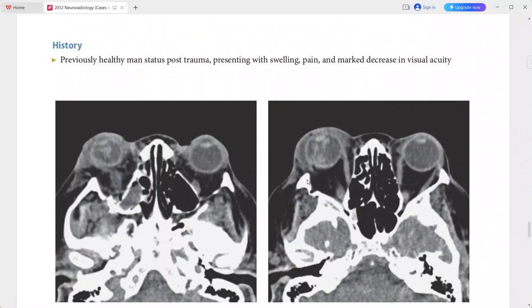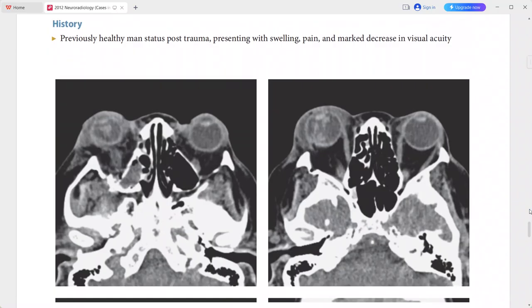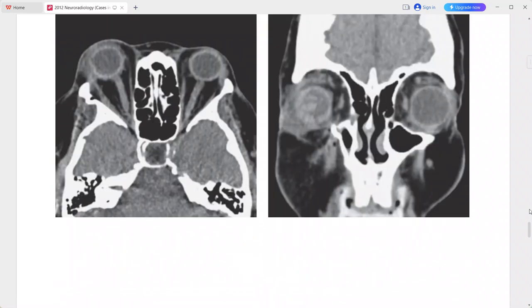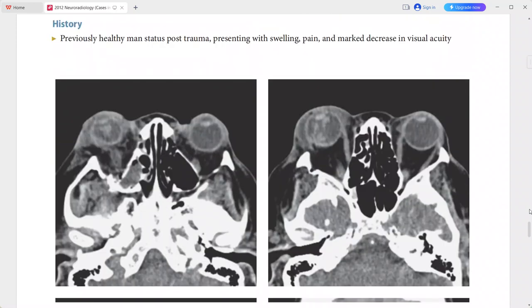Next is a previously healthy man status post trauma presenting with swelling, pain, and marked decrease in visual acuity. On CT scan, there is periorbital swelling on the right side with contour deformity of the right globe. There is high attenuation material within the right globe, likely due to intraocular hemorrhage.